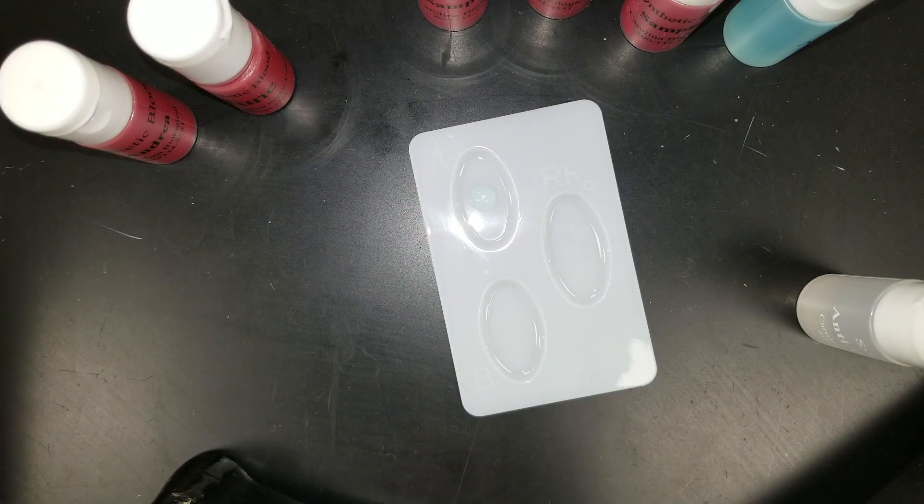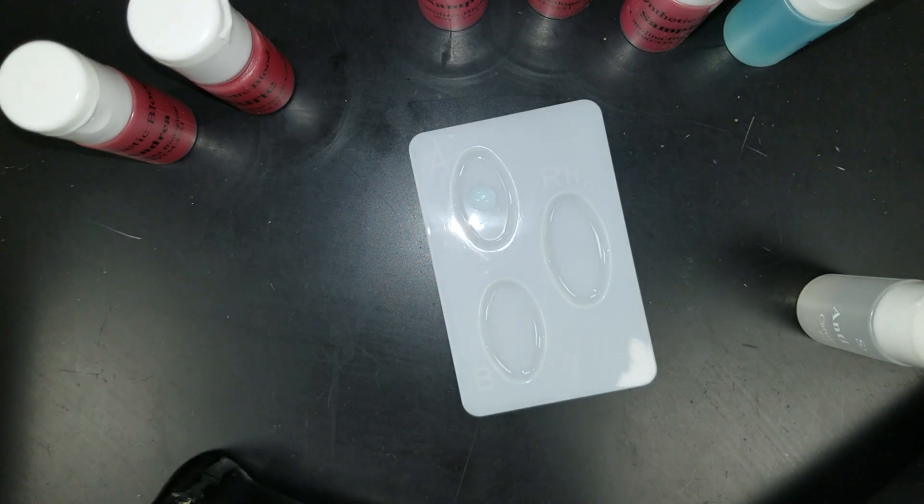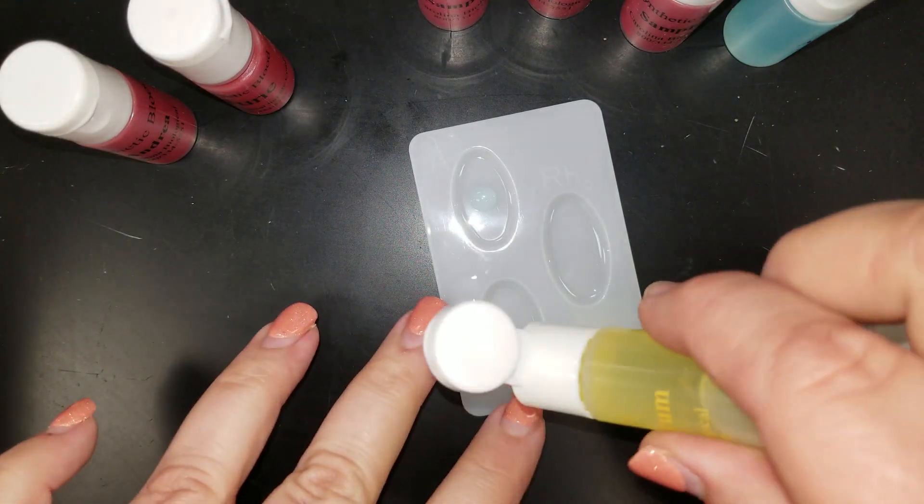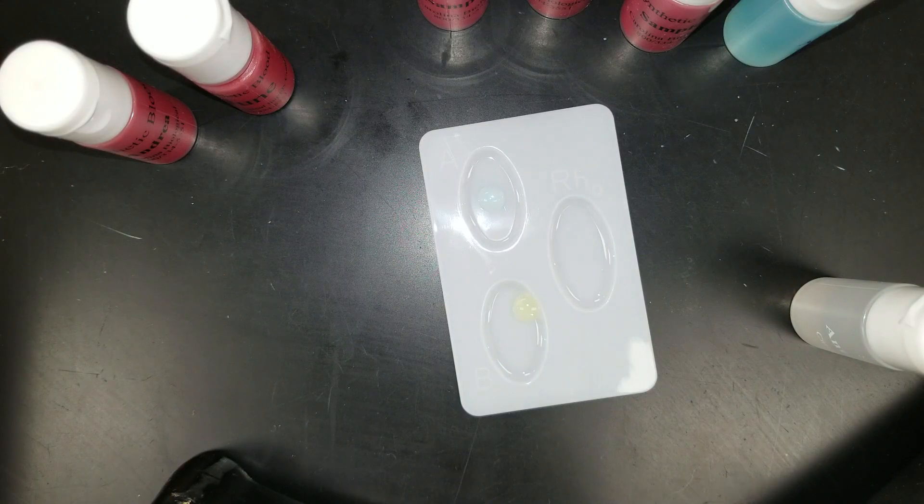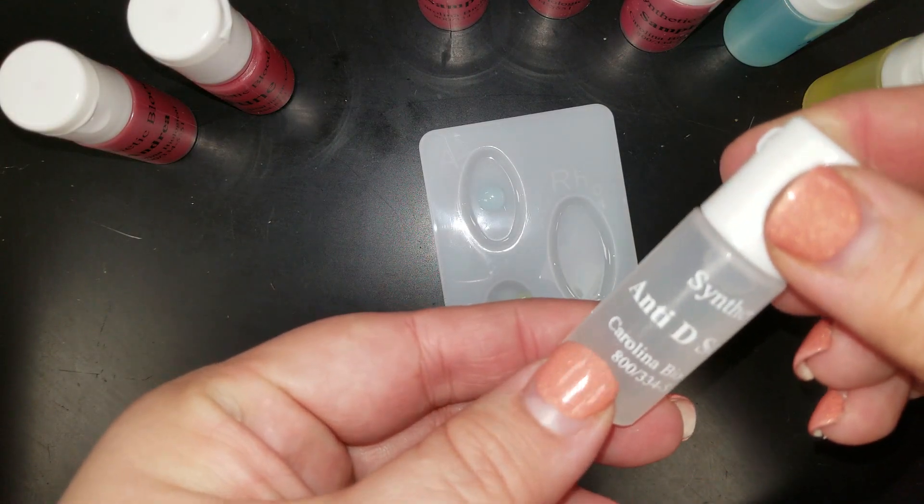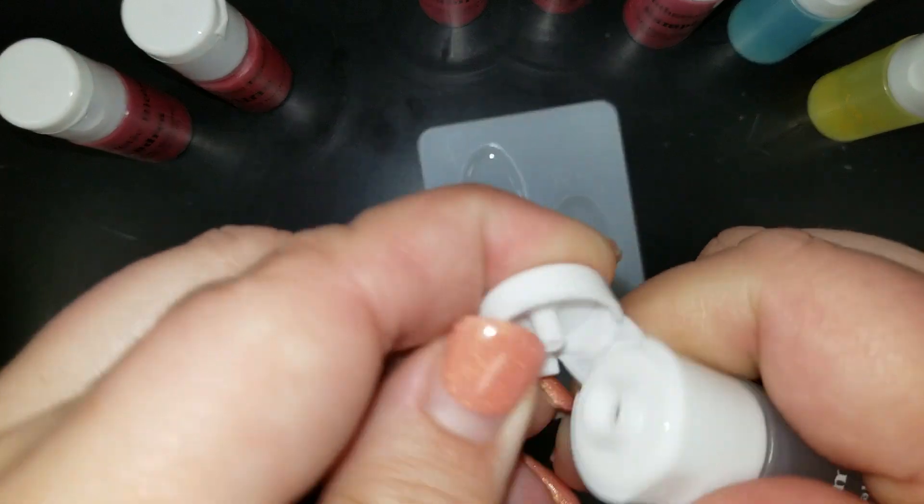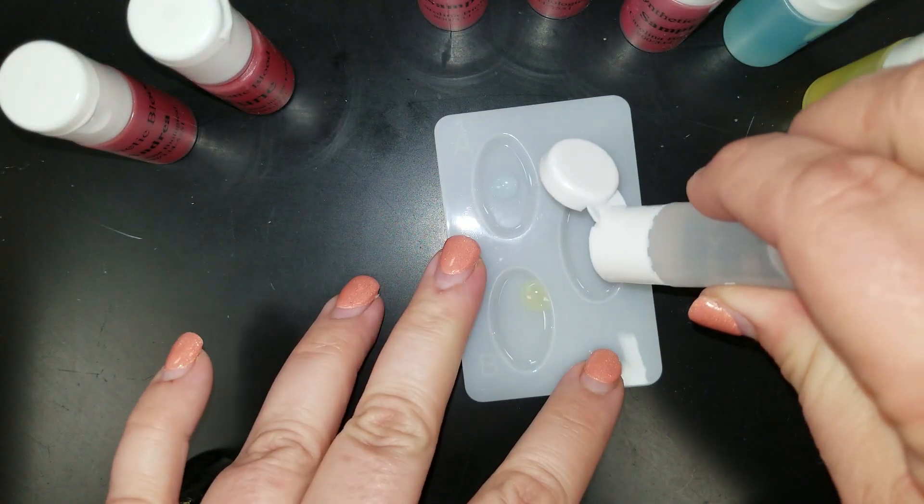And then we'll place a drop of our anti-B serum into our B well. Again, not touching the tip to the well. And then finally, our anti-D serum, which is just clear, we'll go into our last well.